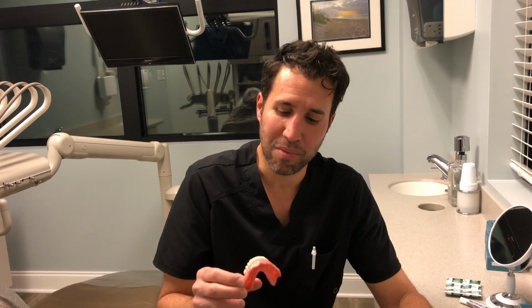It's never the final, so your assistant can fully do this without the doctor doing any work at all. You're not delivering a final product to the patient, because all you have to do is put it in hot water and do it again. But it works great over mini implants as well. That was my next step when it comes to just a perfect immediate over an implant situation.